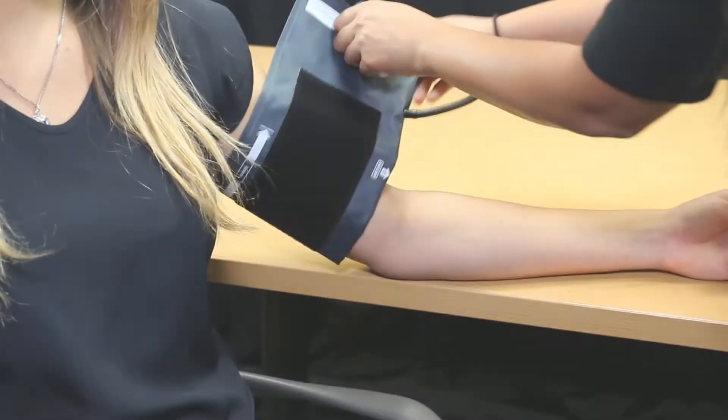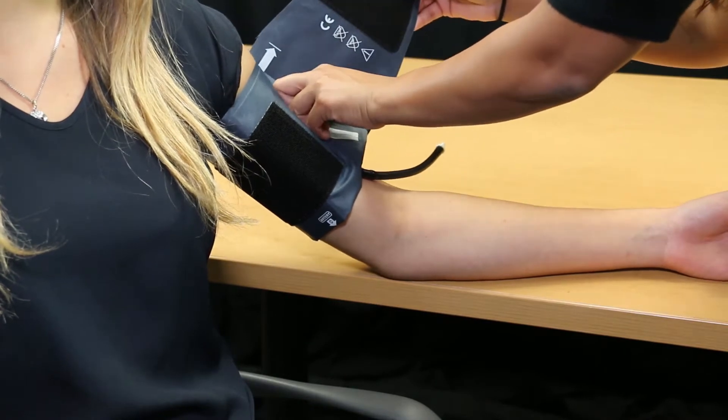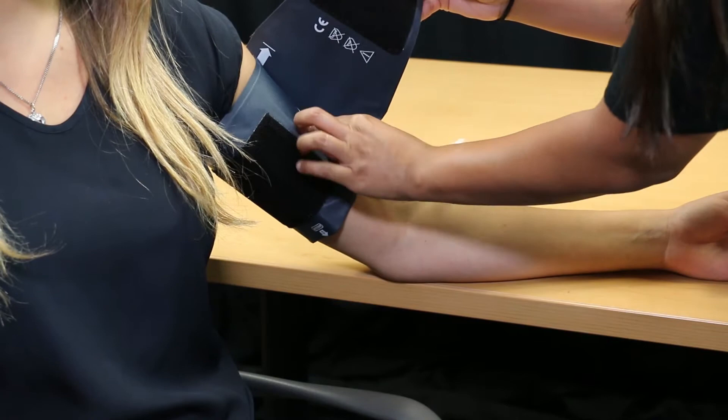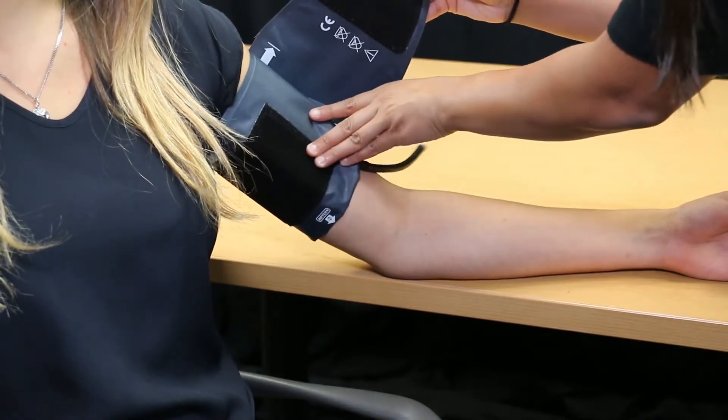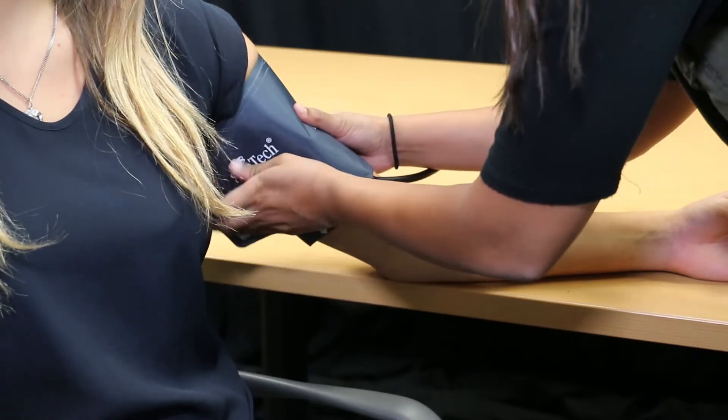The artery marker printed on the cuff must point to the brachial artery located inside the patient's upper arm, right between the bicep and tricep. Wrap the cuff snugly around the patient's upper arm so that the bottom edge of the cuff is approximately 1 inch above the elbow joint.